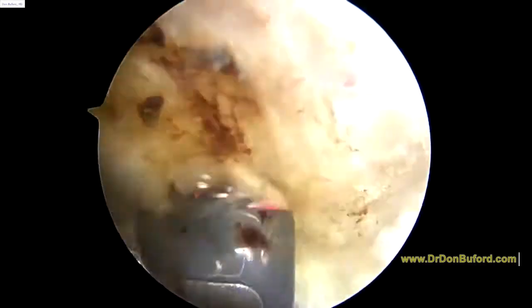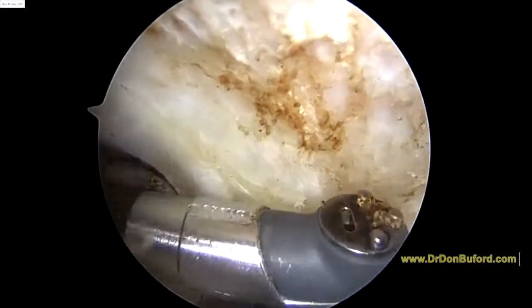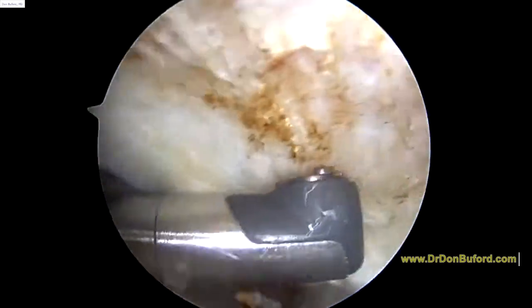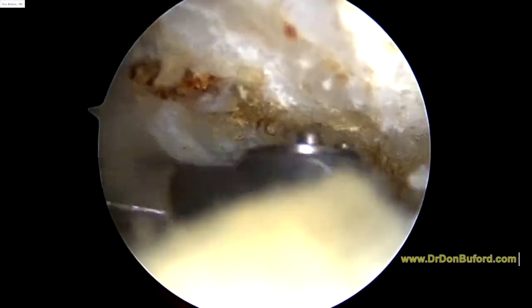Okay, so as we work here, we're starting to see the bone. The burr won't work through the soft tissue. That's why we have to go through this extra step of removing the soft tissue. So right now, let me let it clear up a little bit. Right now what you're seeing, this is actual bone as we remove the ligament and the soft tissue from underneath it. We're trying to identify the lateral edge of the acromion here.